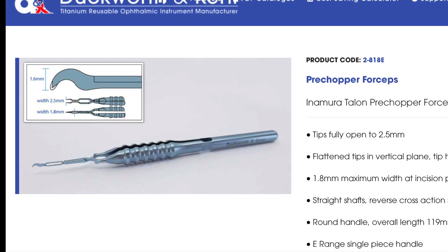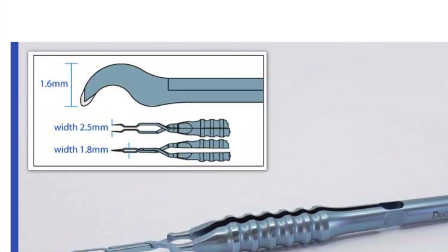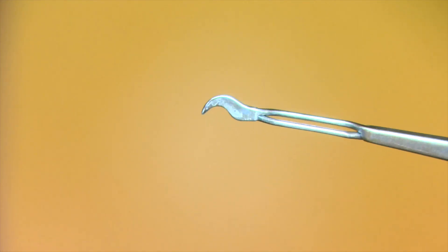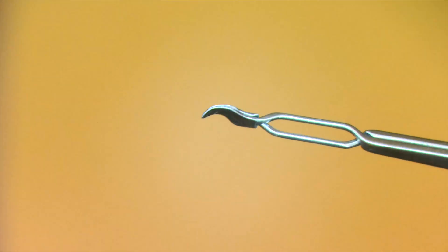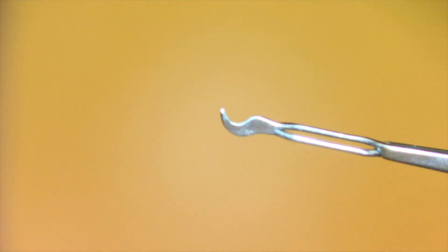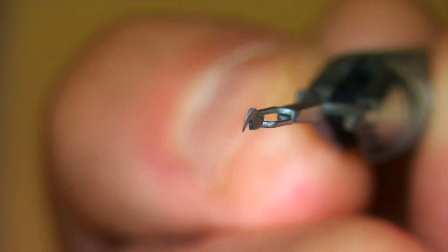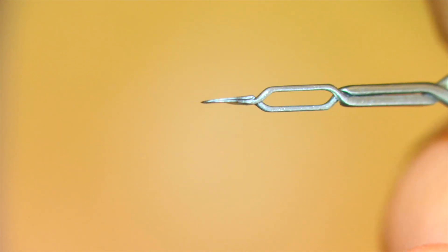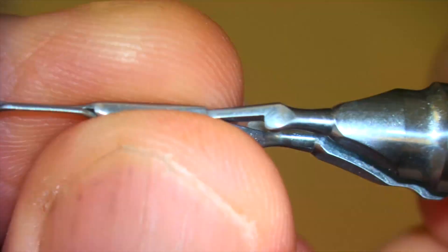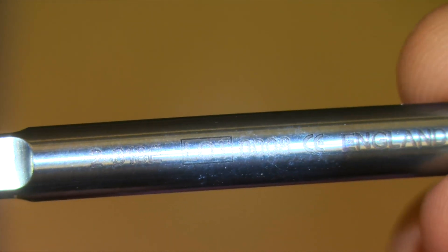Recently, I've been using the Inamura pre-chopper manufactured by Duckworth & Kent and distributed by Crestpoint Ophthalmics. It has a very sharp tip that resembles an eagle's beak. Here's the Inamura pre-chopper as seen through the microscope — you can see the very sharp tip and the cross-section. We use that tip to impale the nucleus, purchase it, and then divide it. It is model 2818E, the Inamura pre-chopper model 2818E. I have no financial interest in this product — I just started using it and I happen to like it.